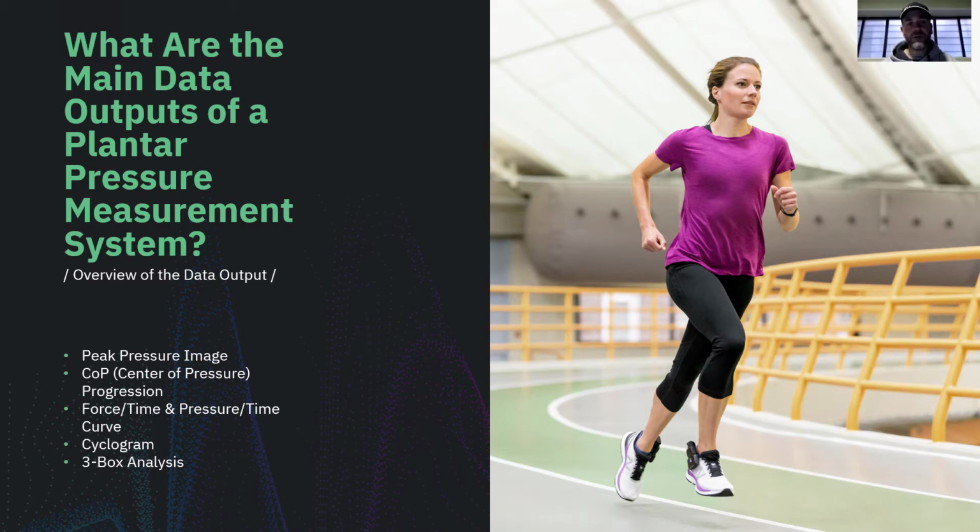The first is the peak pressure image. The second is the center of pressure progression. The third is the force time and pressure time curve. The fourth is the cyclogram analysis. And the fifth is the 3-box analysis.